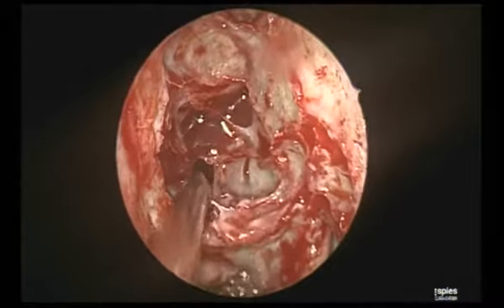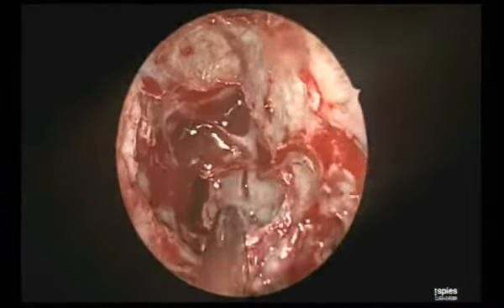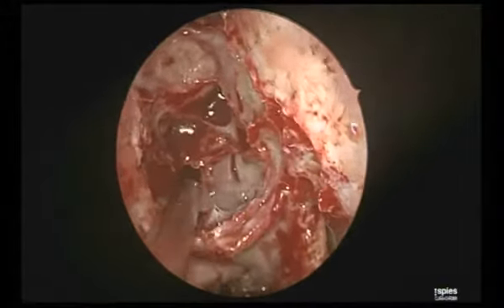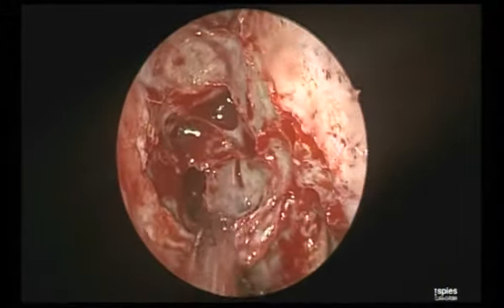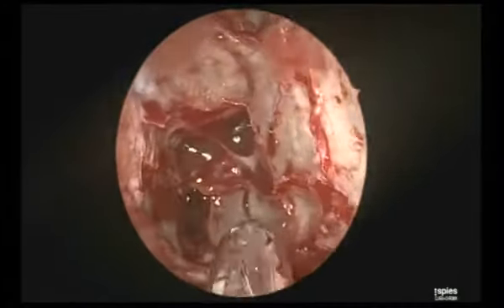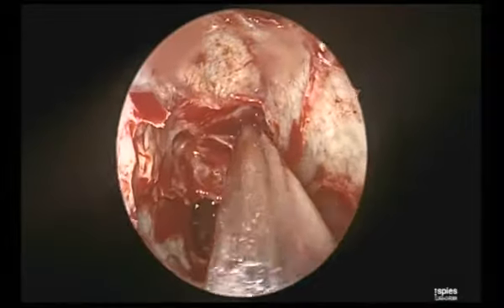Now this area that he's doing, a lot of us tend to leave some cells here. This is the commonest, very important, and how we learned it was we would finish a FESS and then ask Satish to take over and see what we had left behind. And very honestly, we didn't even see that so many cells were left there, until he would remove them.